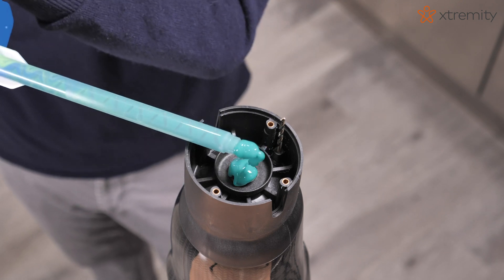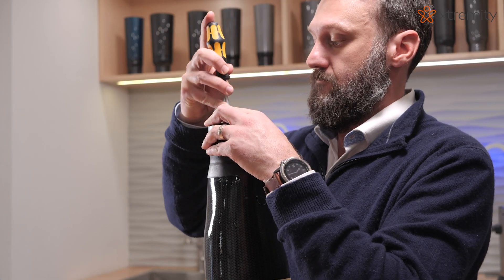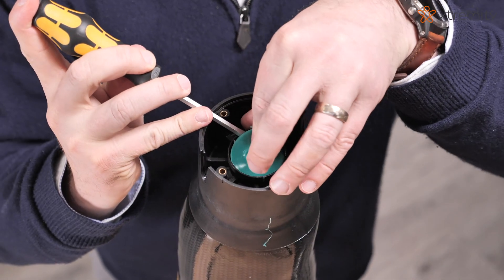Let the silicone set for approximately 15 minutes, and then remove the distal end pad injection valve and drill bit if using vacuum.